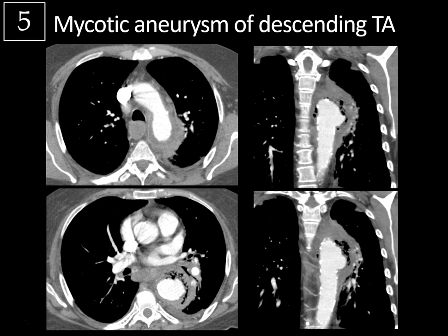Mycotic aneurysms occur in the setting of infection of the arterial wall, usually bacterial, often from hematogenous spread, typically from infective endocarditis — but direct seeding from an adjacent infection can also occur. In this case, the patient had an esophageal perforation that seeded the area and evolved into this mycotic aneurysm. Clues to mycotic aneurysm include fluid and aortitis of the adjacent aorta, multiple foci of gas surrounding the aneurysm, and a saccular rather than fusiform shape with an irregular multilobulated appearance. They often occur in atypical locations for atheromatous disease.